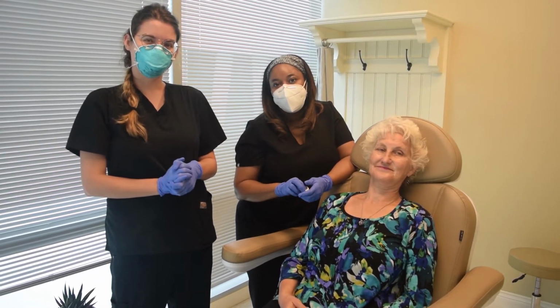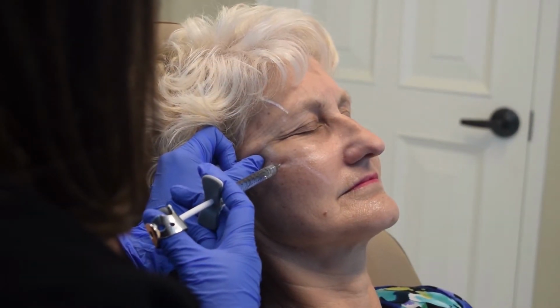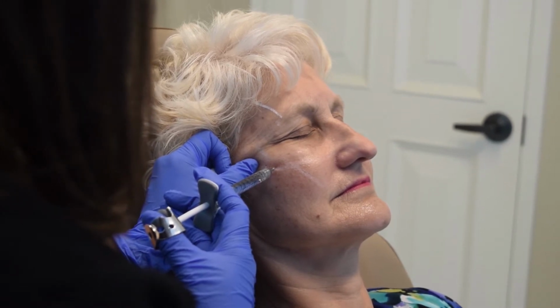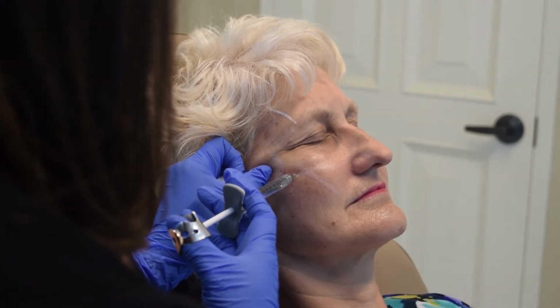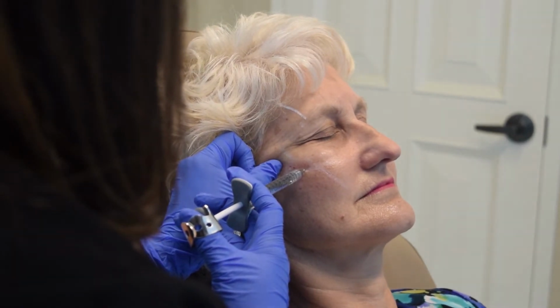client here. And we're going to start by cleaning her skin and then you'll see all the fun as it goes. So right now we are lifting back the tissue. We wanted to provide her a little subtle lift with some volumization. So I'm just doing really small aliquots of product right into this layer to give her a little bit of lift. So she just feels a little pinch, but you're seeing that tissue kind of just hold up nice and gently.